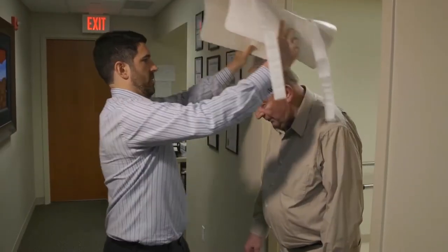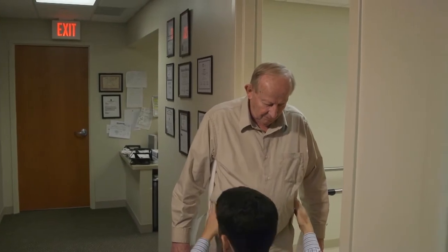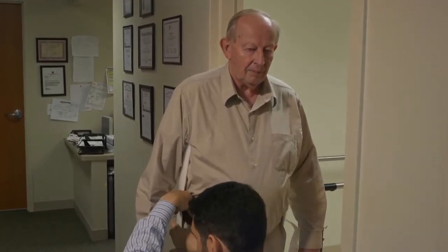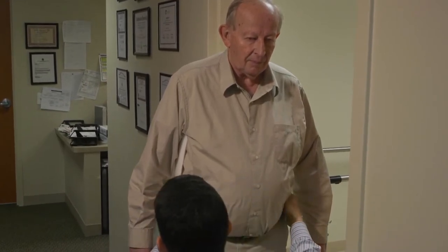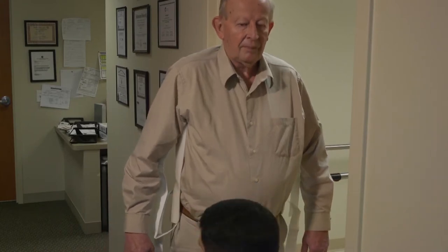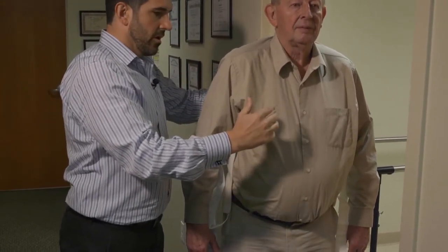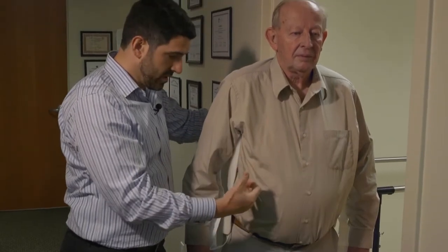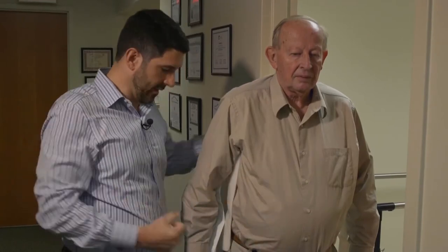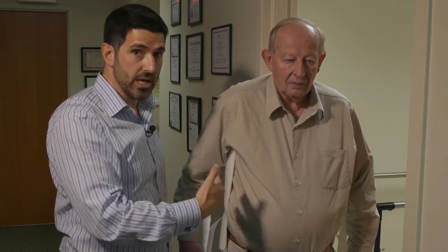We're going to put this on Bob here. I'm going to find the top of Bob's iliac crest right here — and since here's my groove, I have to come up on Bob a little bit. The reason why we do this in the door jamb is a couple different reasons. When Bob takes one of these straps and pulls back like this, if he's against a wall and pulling back, he's going to hit the wall. So that's one of the reasons why we promote the door jamb for patients.